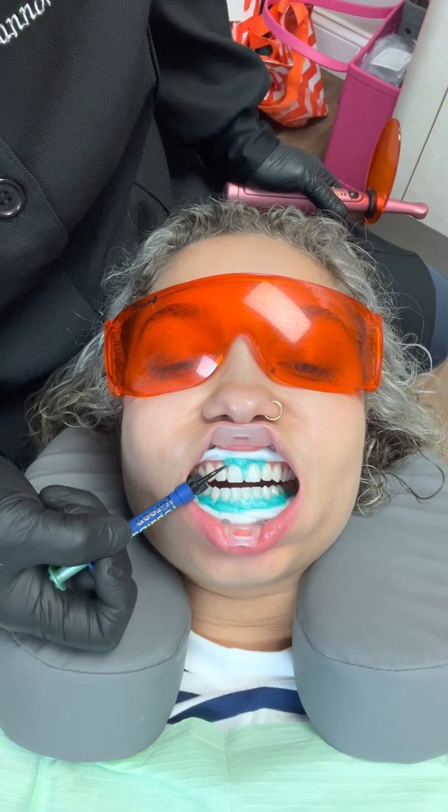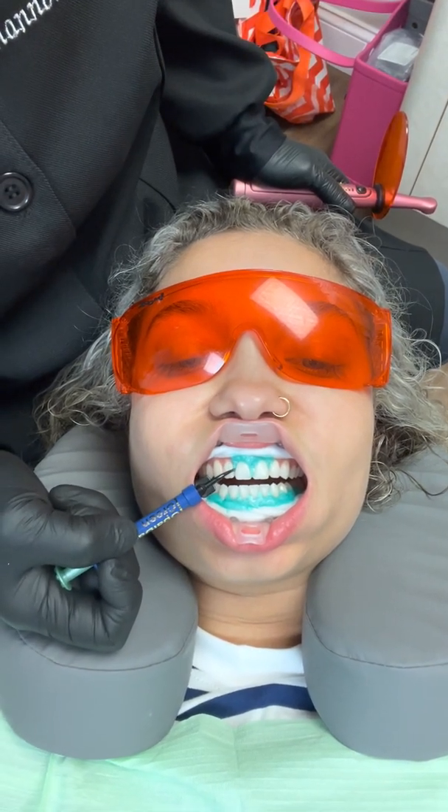Because you have a little space, I want to make sure that bleach doesn't go through this little area right here. So look what I'm going to do — see that? Same here. Just so you know, if you ever do bleaching on somebody with these little spaces, I don't want to burn you.